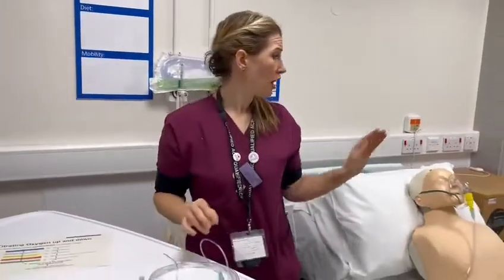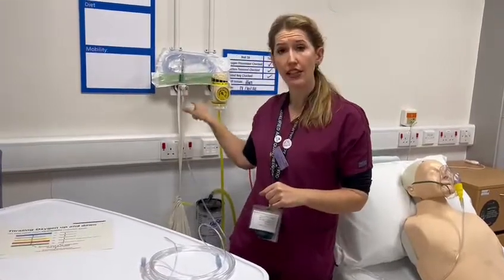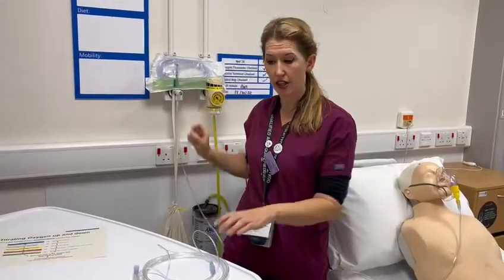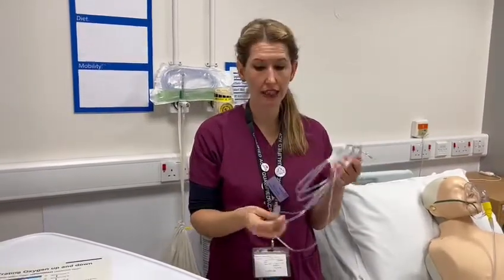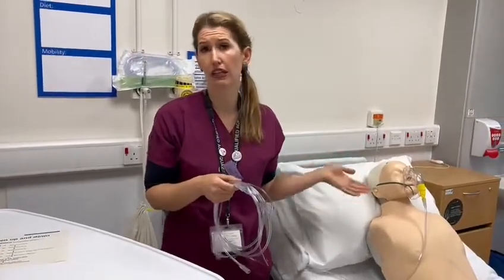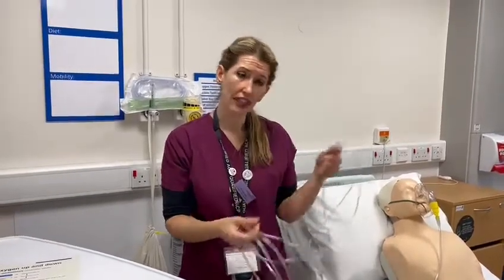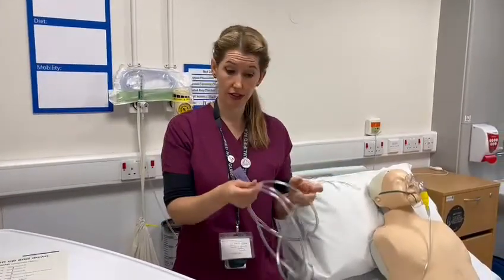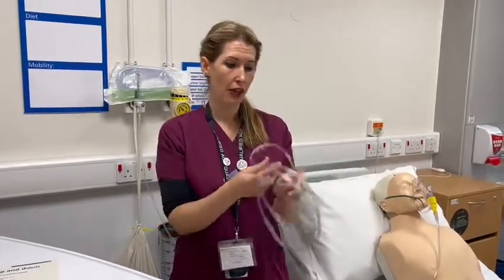So for our 35%, they've currently got 8 litres coming through the oxygen flow meter. Now, according to our chart, if we want to convert them to nasal cannula, we want to put them on 4 litres. Now, we don't want to leave our patient without oxygen because they are hypoxic and need this amount to support them. So I would make sure that I have everything available to us when we're starting to make that change. So make sure you get hold of your nasal cannula.